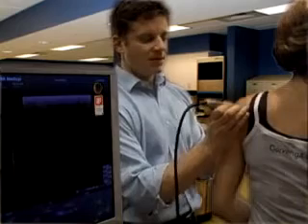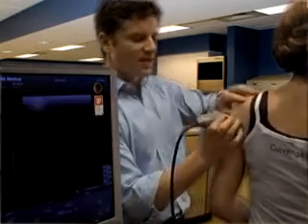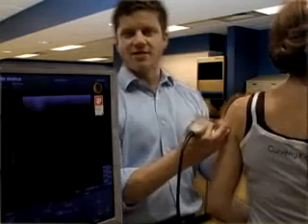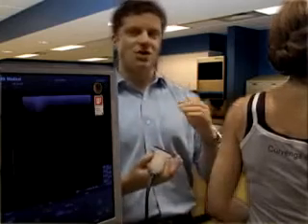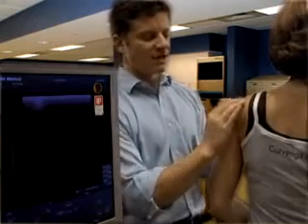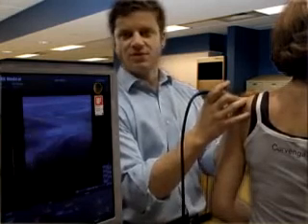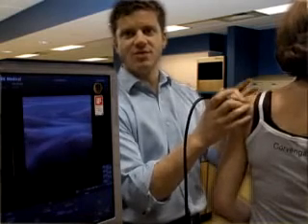I'm going to place it right over her humeral head where the joint area should be. In a model like this you can obviously see it quite well. But if you have a larger patient where it's not as prevalent, one way of finding the joint is walking off the edge of the acromion, and as you dip down, most of the time you'll end up right on the joint — and that's the view that you want.